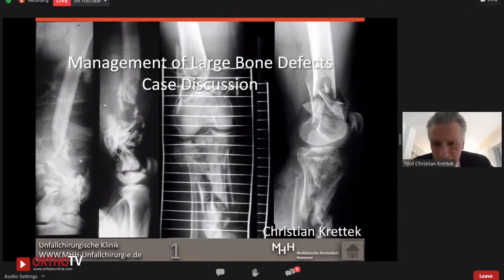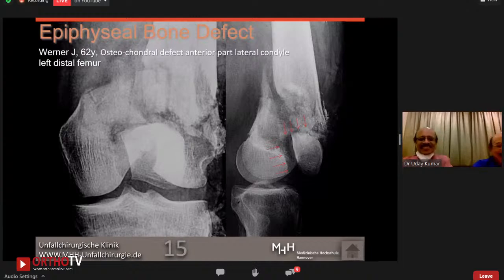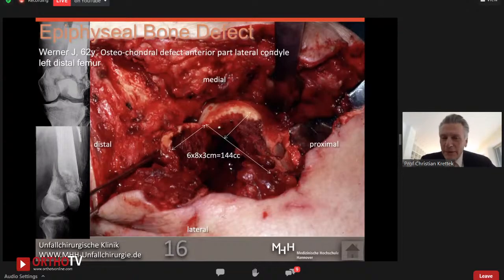It's about bone defects, and I have three cases, and I would like to share them with you. The first one is a little bit more easy, and it's a 62-year-old patient with a large osteochondral defect of the distal femur, of the anterior part of the lateral condyle. And the bone is gone, and even the police dog could not find it. So, we have a problem. And this is the intraoperative situation, where we have a 6 by 8 by 3 centimeters, so it's 144 cc defect.